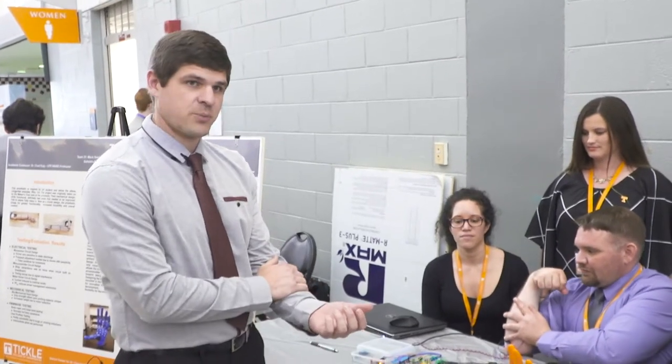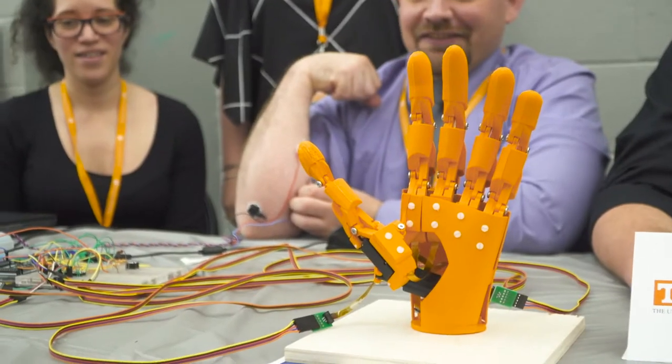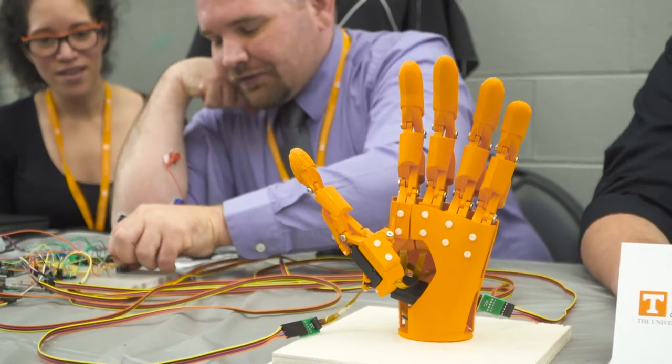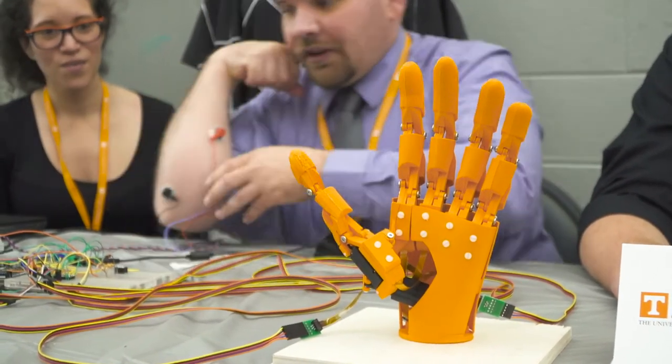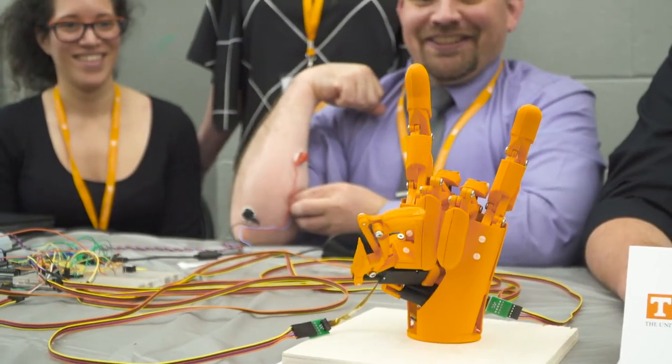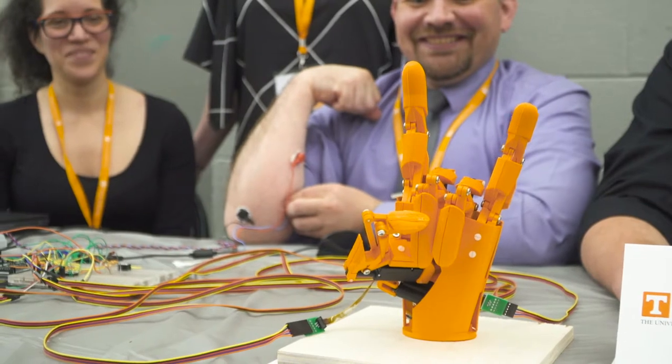It still needs development into the forearm portion of the prosthetic, and the wrist still needs to be developed as well, because that will include full rotation and things of that nature. Further improvements can be made and I hope to see in a few semesters a fully functional prosthetic arm.